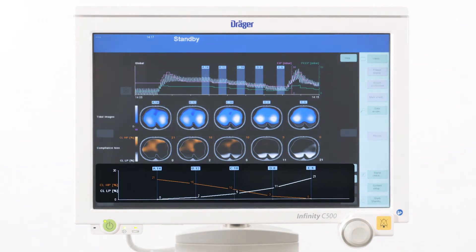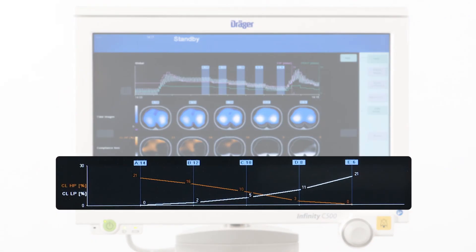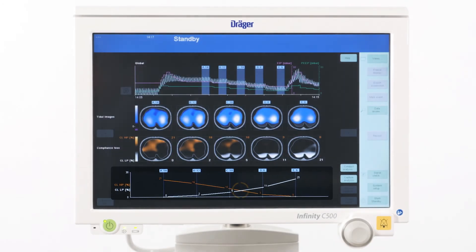In the diagram displayed at the bottom of this diagnostic view, we see the typical pattern of a properly conducted PEEP trial. We can observe an opposing trend of collapse and overdistension with a clear intersection at a certain PEEP level.